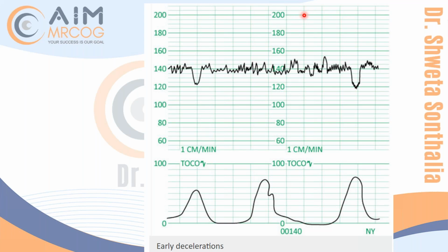Is anyone interested to open their mic and explain it to me? Yes, ma'am. The baseline heart rate is 140 beats per minute. Very good. And there are three contractions in 10 minutes. Very good. So, three, yes.